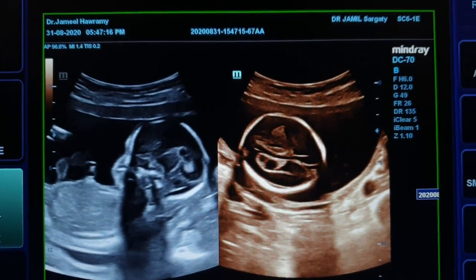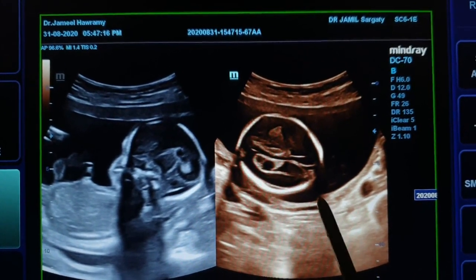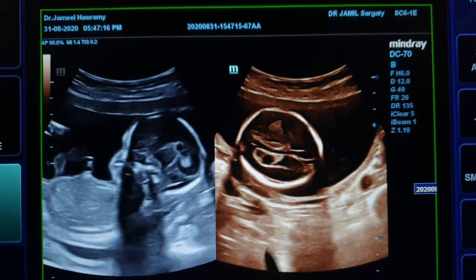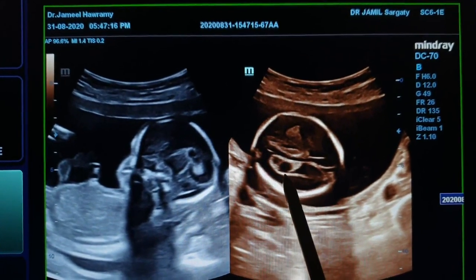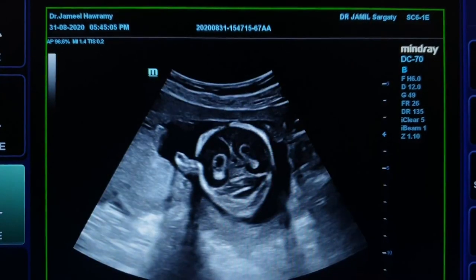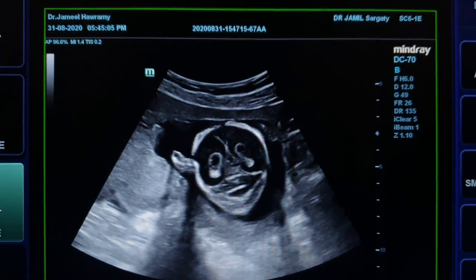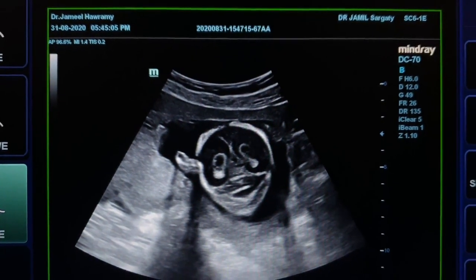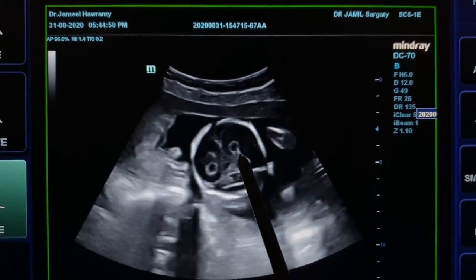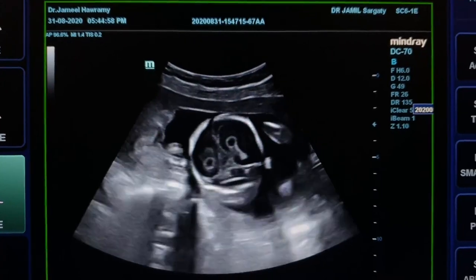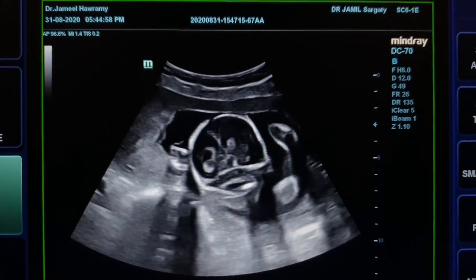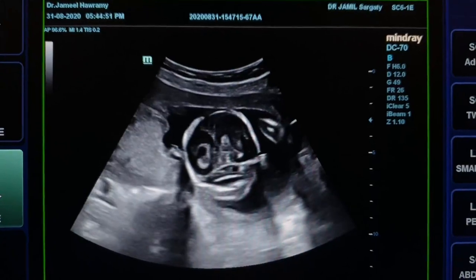Obstetrical ultrasound transverse section and sagittal section of the fetal head showing a choroid plexus cyst. In another scan, a short clip showing bilateral choroid plexus cysts.